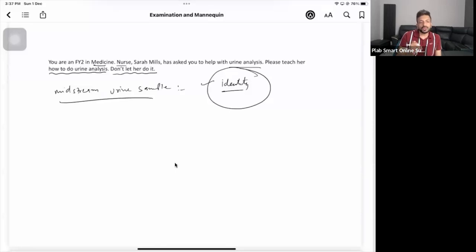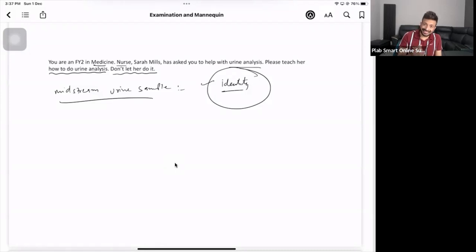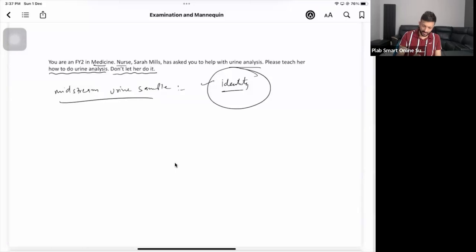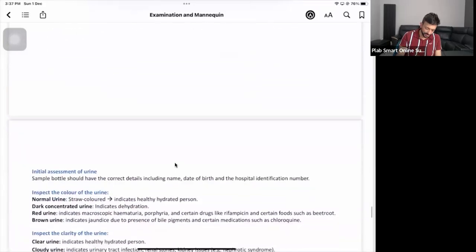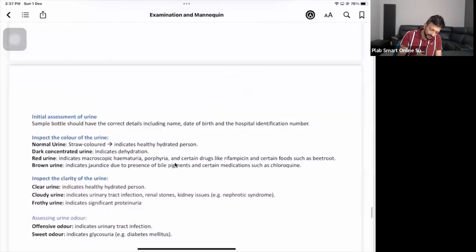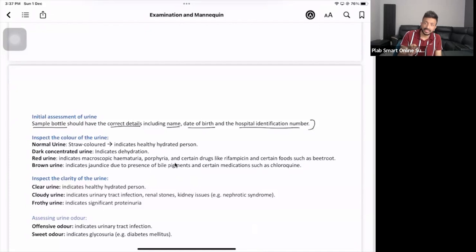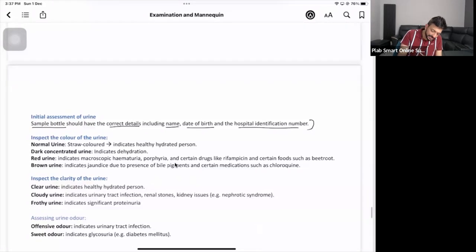Before we jump into the urine dipstick testing, do a bit of inspection with the staff member. Initial assessment - the urine sample bottle should have the correct details including name, date of birth, and hospital identification number. Then inspect three things: color, clarity, and smell.